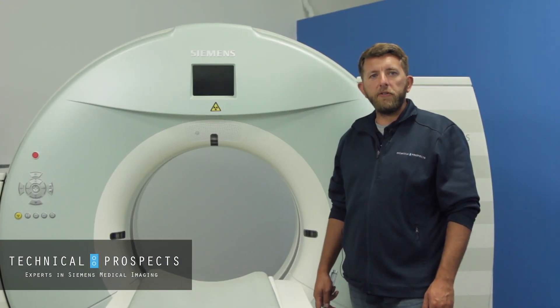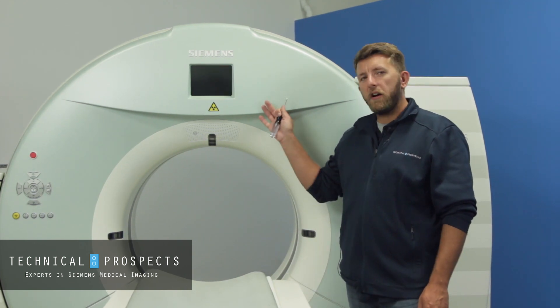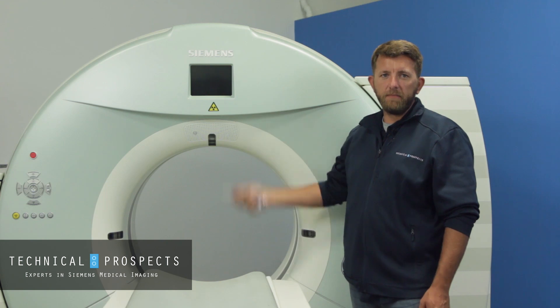Hello again, it's Kevin here at Technical Prospects with another tech tip video. Today we're going to talk about opening the front cover on a Definition AS system.